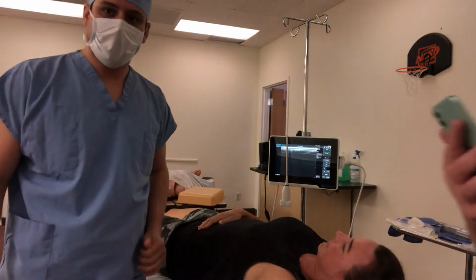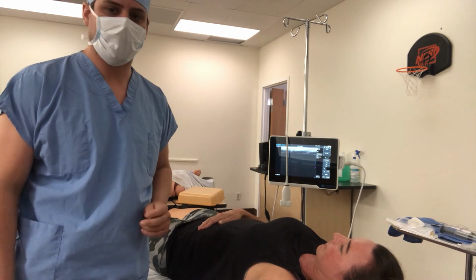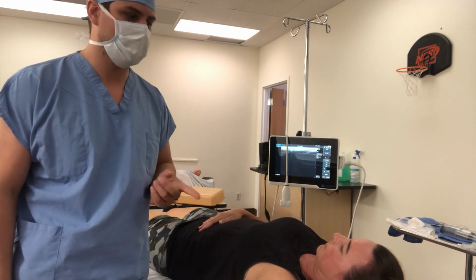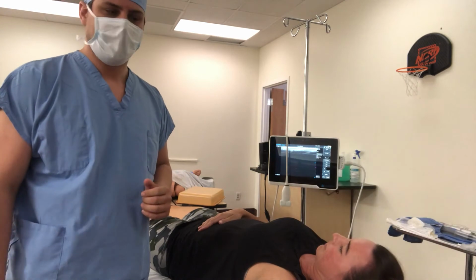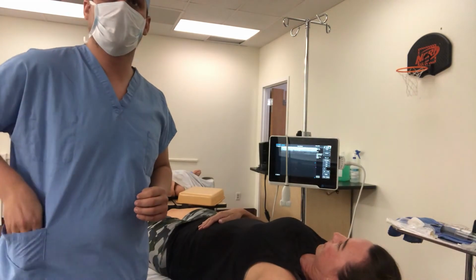All right, today we're gonna do an axillary block as well as an adductor canal block. I have Case with me and Brittany. The time is 11:29. That's 15 minutes from when I got the text.